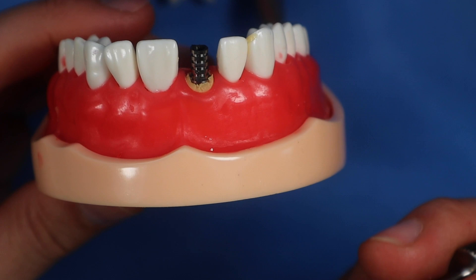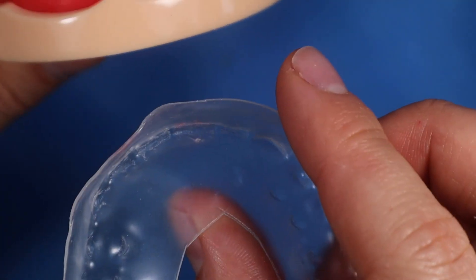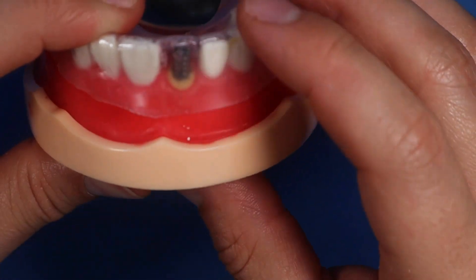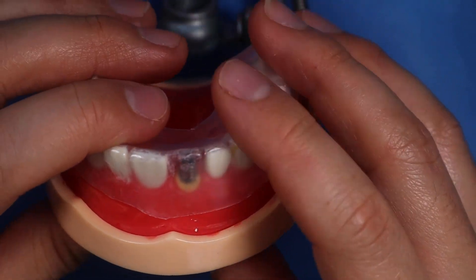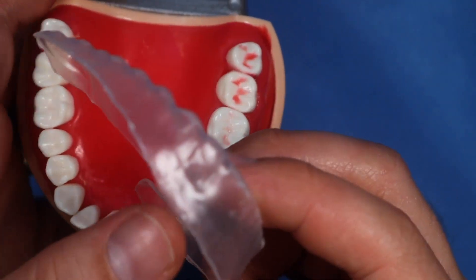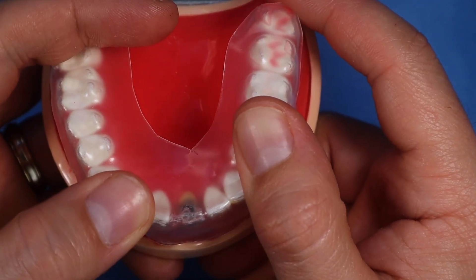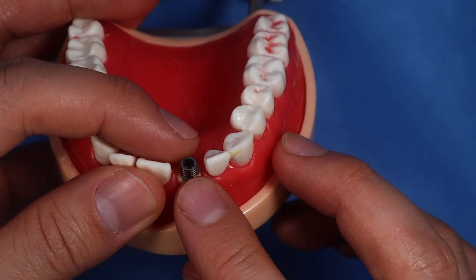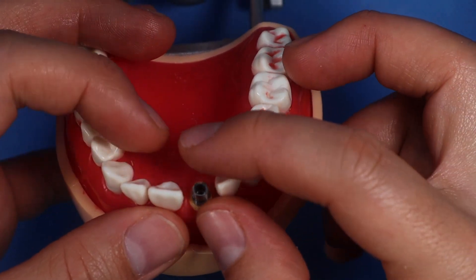The cylinder goes back on, tightened up, and now it's shorter than the occlusal surfaces of the other teeth. So if you put some temporary material in the vacuform splint and squish it down over this, it'll work just fine — the cylinder is no longer in the way. You put temp material in there, plug the access with a cotton pellet, squish the splint down, let it set up, and peel it off. Then find the access hole again with a handpiece, make a little hole in the occlusal surface, and work it until it looks like a nice tooth.